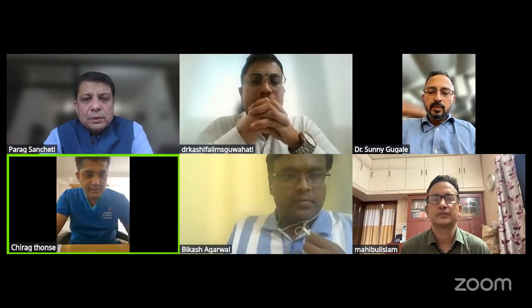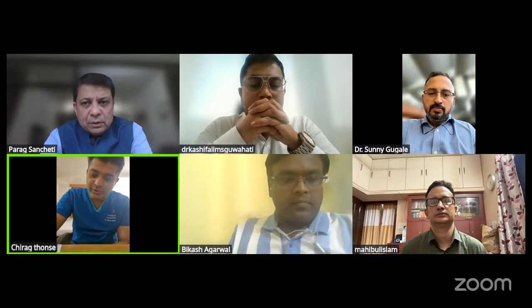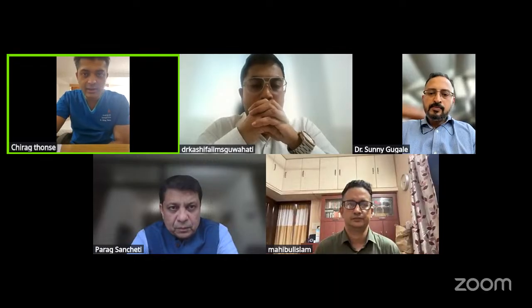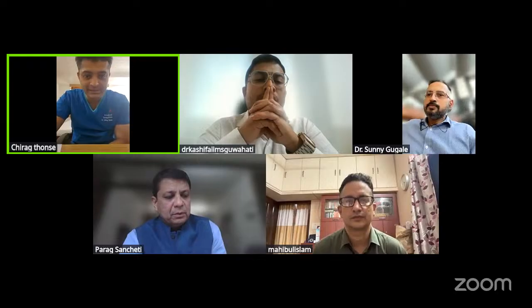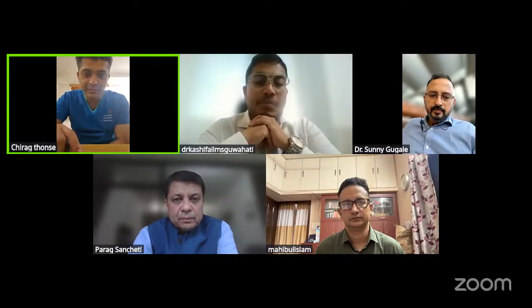Thank you, sir. So this was a very wonderful insight by Dr. Kashif. Now, the posteromedial portal becomes a very integral part, typically in your ACL injuries, because we know that some subset of these ACL injuries, at least 8 to 10% of them, do have ramp lesions. So in case I detect a ramp lesion, when I slip in my scope through my PCL and the medial femoral condyle and suspect a ramp lesion, I will definitely make a posteromedial portal after doing my needle test.